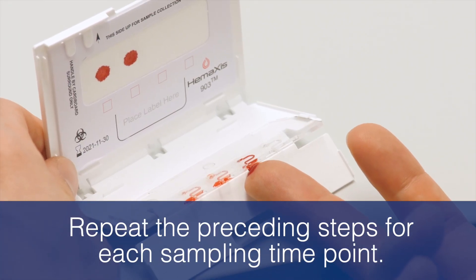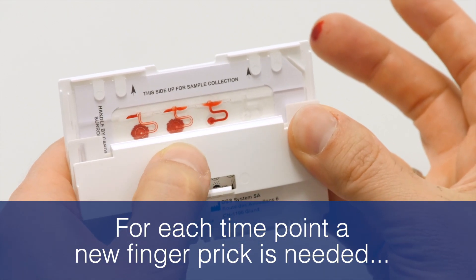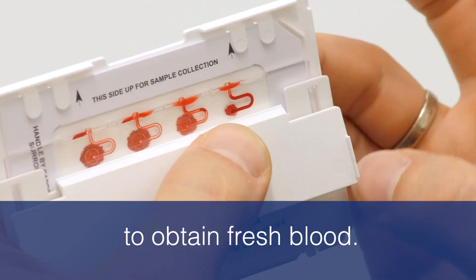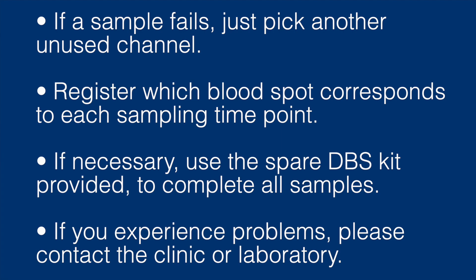Repeat the preceding steps for each sampling time point. Use a new and unused channel for each sample. For each time point, a new finger prick is needed to obtain fresh blood. You may use a different finger for each sample. If a sample fails, just pick another unused channel. Register which blood spot corresponds to each sampling time point; failed samples can be marked with an X. If necessary, use the spare DBS kit provided to complete all samples. If you experience problems with sampling, please contact the clinic or laboratory for troubleshooting.